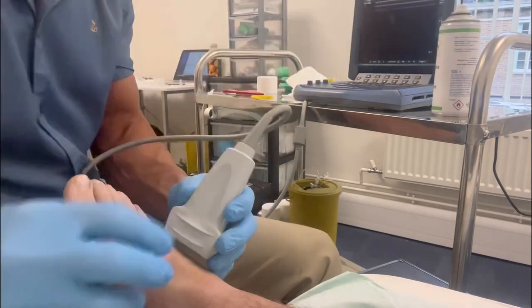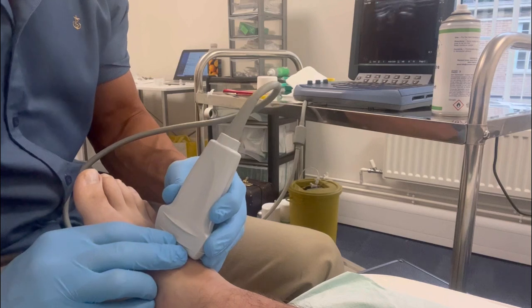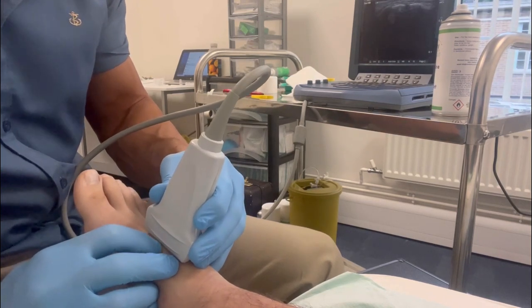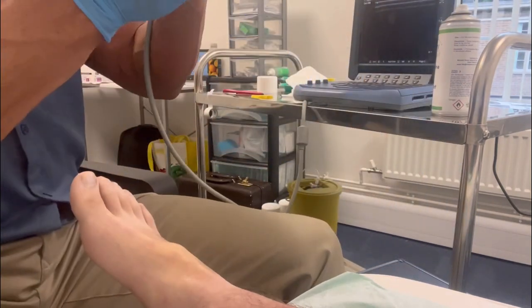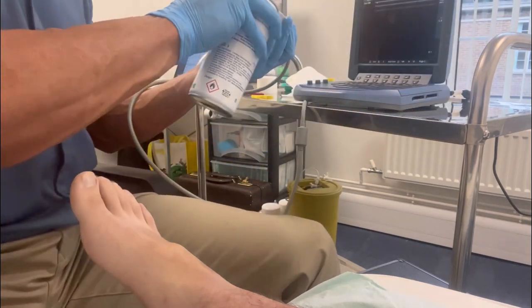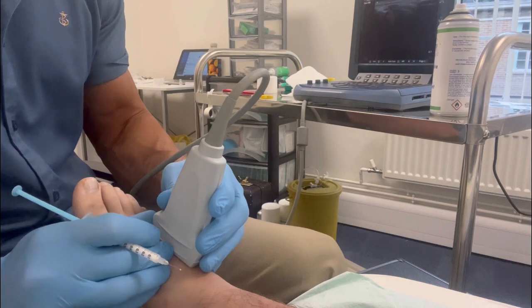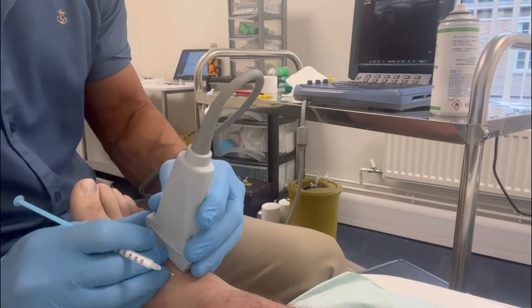There is now a large dorsal osteophyte overlying the injury, and we are administering a corticosteroid injection to help manage his symptoms. It's important when doing this under ultrasound guidance to highlight the osteophytes and the overlying tendons, nerves and blood vessels, which you've seen me just mapping them all here.